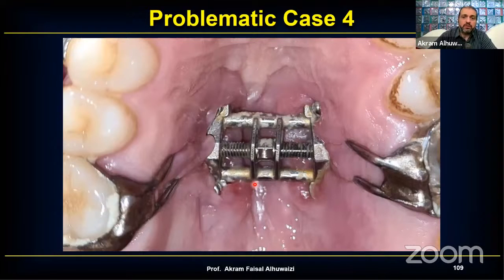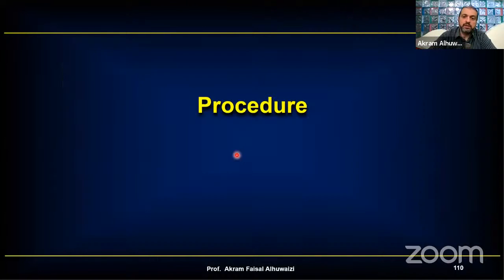Which cases are more problematic? Well, most of the cases, they're adult males over 20 years of age. These are the challenging ones. Females are less challenging, but adult males are more challenging. So let's go through the procedure. How do we actually do MARPEs?